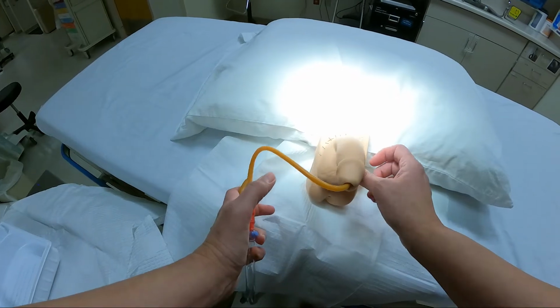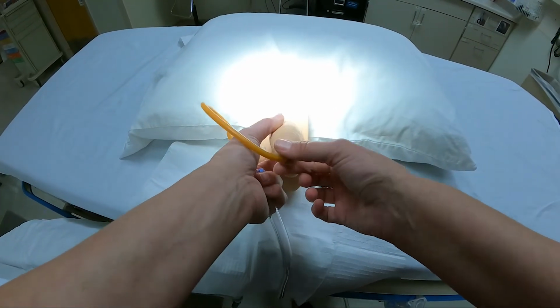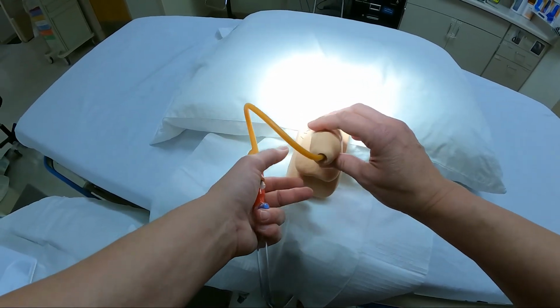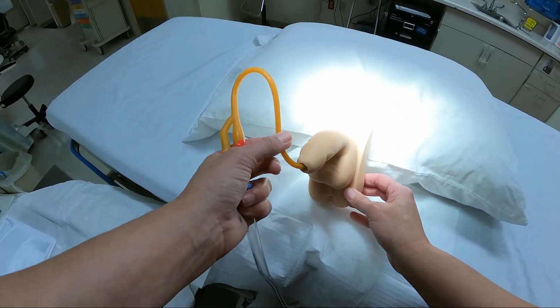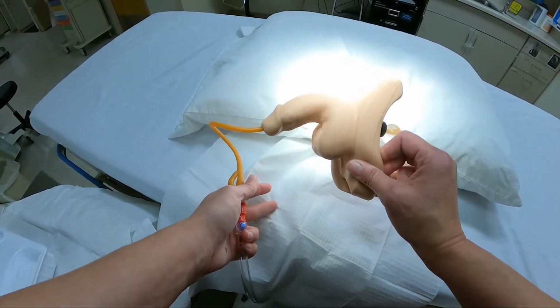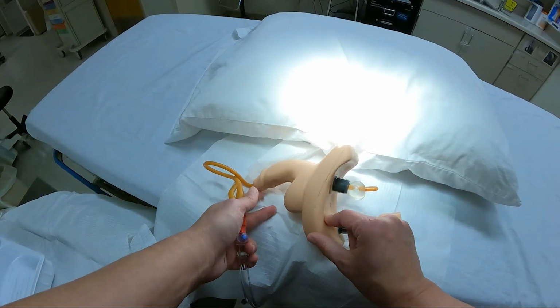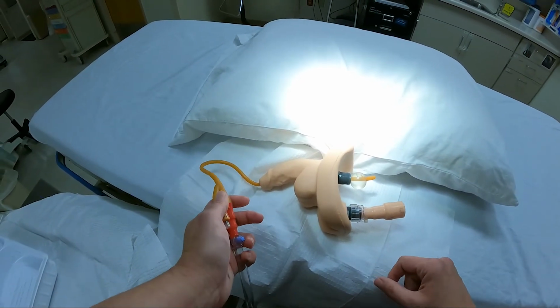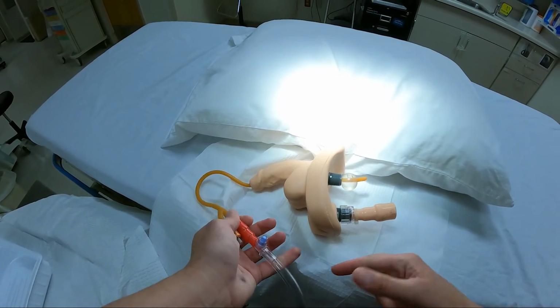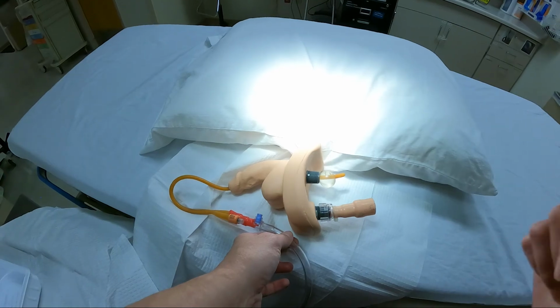After that's done, make sure, especially if they aren't circumcised, that you retract the skin back over the head of the penis, because if you don't, they're not going to like it, and you're going to go, oh my, next time you assess the patient, or anybody assesses the patient, because it will swell. And getting the skin back over the glans once it's swollen is a little bit tricky sometimes. And again, catheter care daily, and when criteria has been met, pull it out. And that is it.